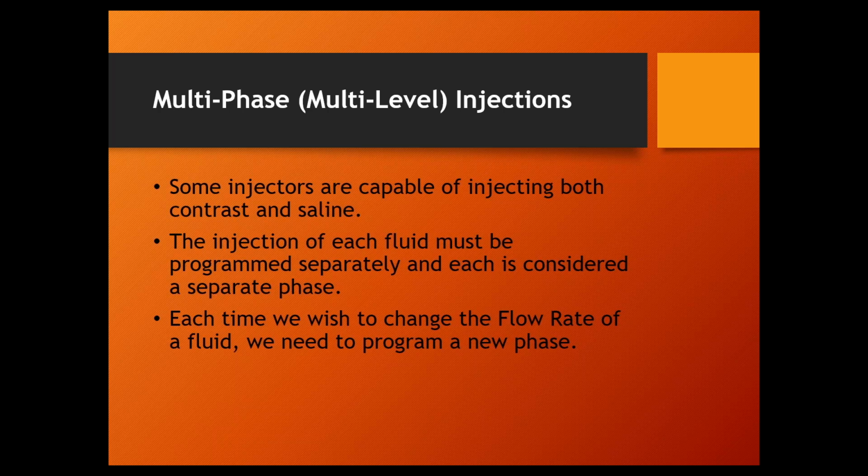Contrast goes first for about 4 seconds. Well, exactly 4 seconds. Then it automatically switches over to the second phase and does the same thing for the second. So that's a 2-phase injection. All right. Any questions on that? Most injections, maybe all injections, are multi-phase or multi-level injections.